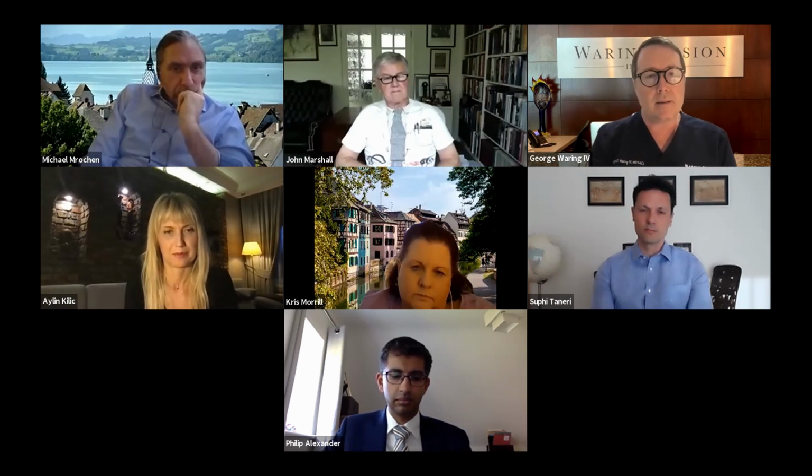And keeping in mind, as the representative US delegate on this panel, we're way more hamstrung than you all are. Remember, you have the luxury of being in the free world, where you've got access to amazing cutting-edge technology. We're 10 years behind here. So enter extended depth of focus optics. That was a game changer in the US because it did create a broader depth of focus curve, but it left us lackluster on real reading correction.